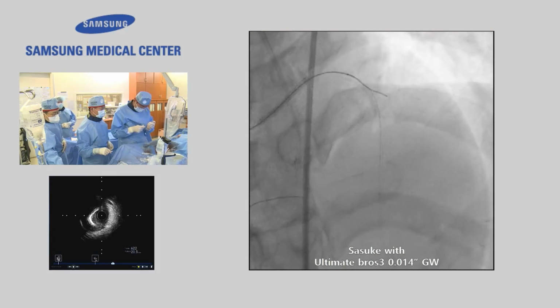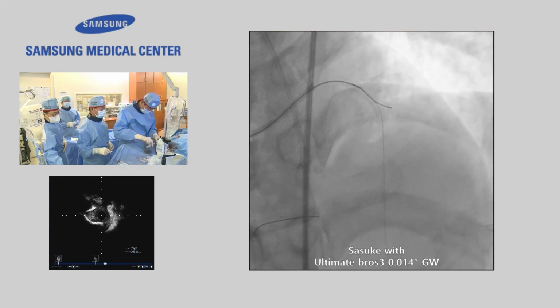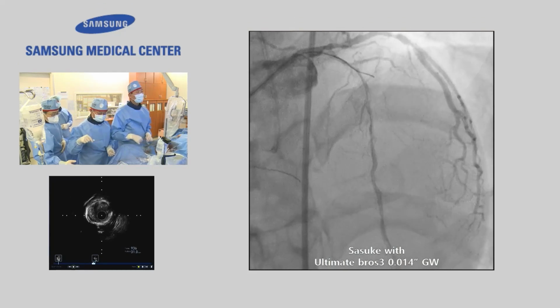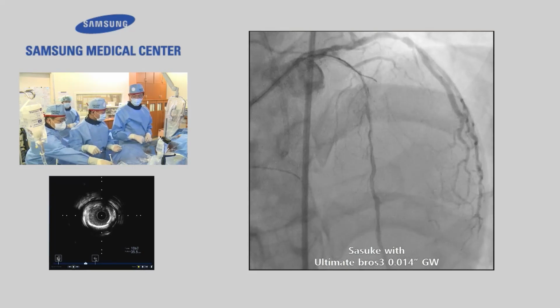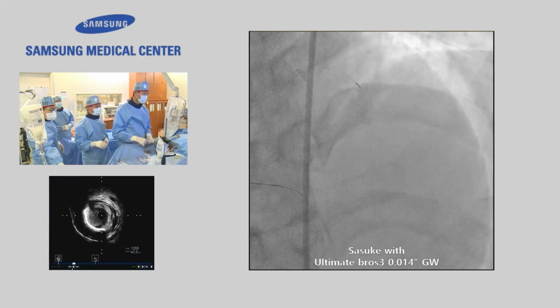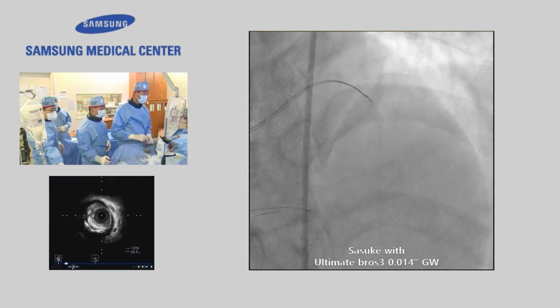However, you are using, I think, the bright tip guiding catheter. So only the bright tip catheter cannot accept that technique. Really? Yes, because the inner lumen of the bright tip is so small. Small, yeah. Okay. So then we have no choice but to proceed like this.